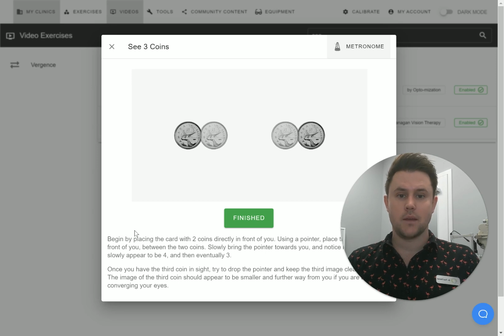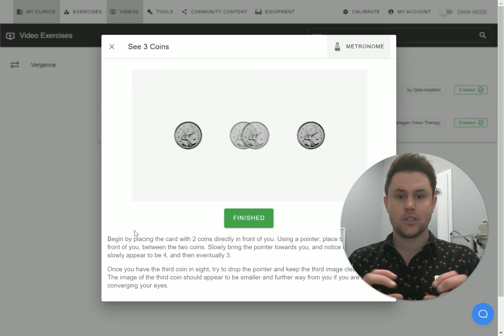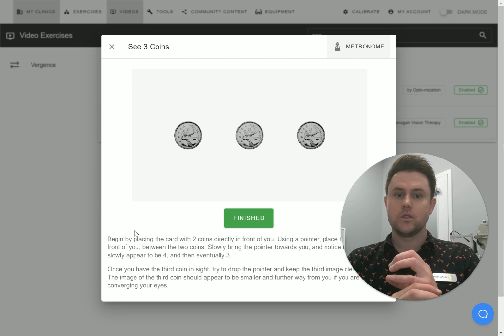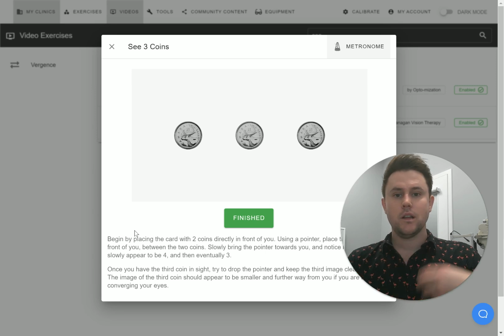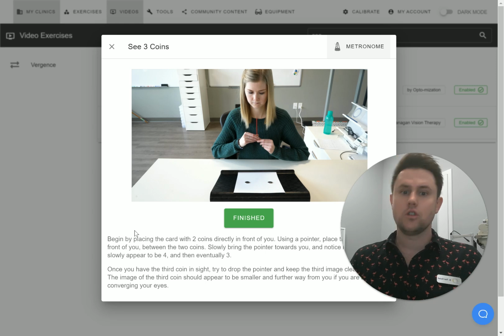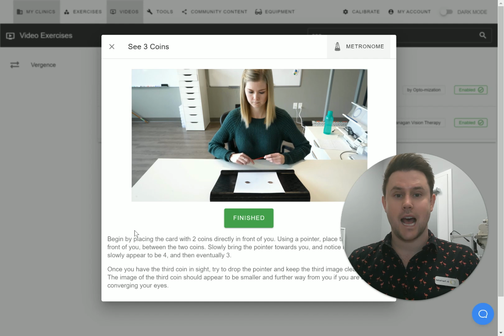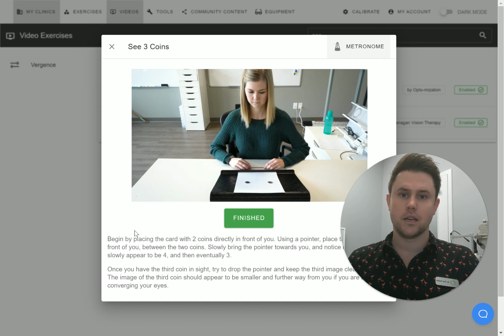One of the nice things with the animation here is it's going to show you exactly what's occurring. And as you get closer, they're going to start fusing in together. So it's giving people a visual at home. Sometimes if you send it home with a parent who wasn't there to observe or a patient who hadn't totally grasped the task, we usually find it takes a few weeks for people to get this.